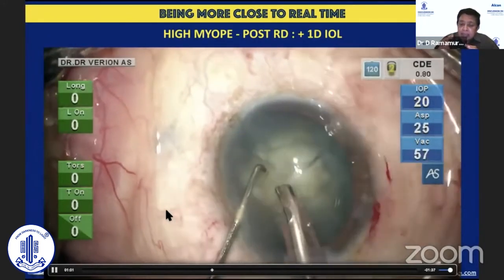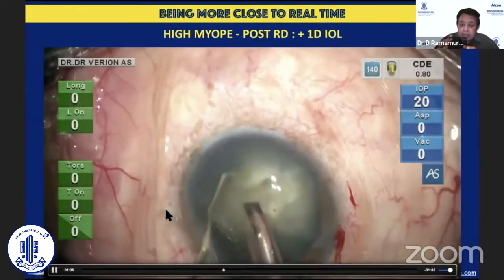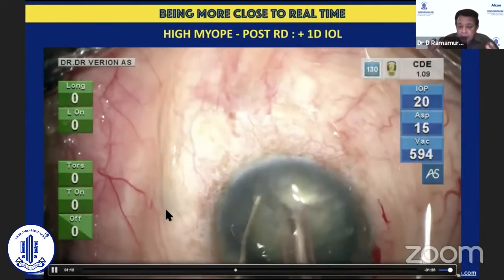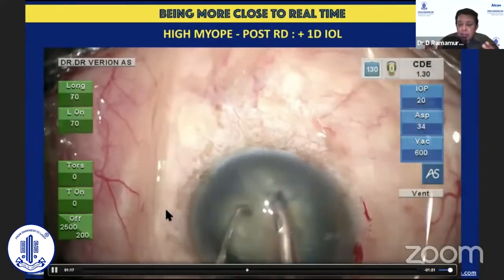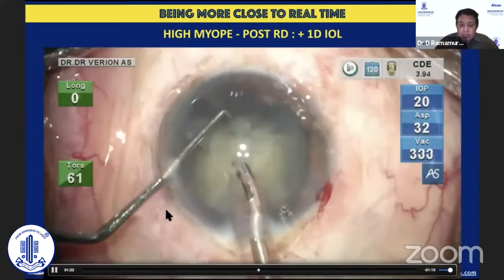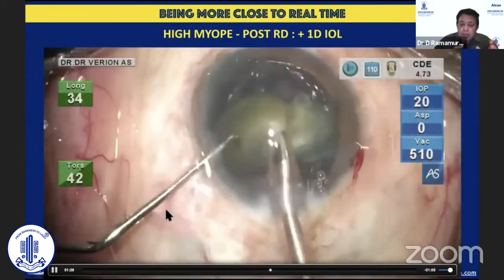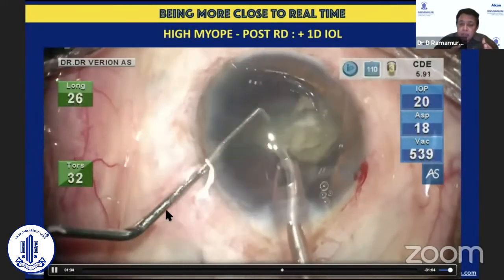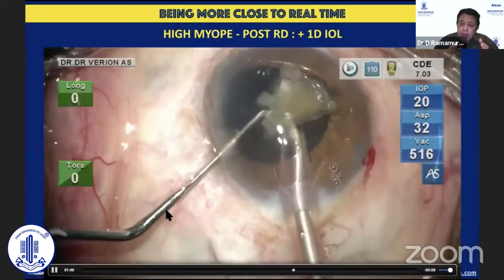But having said that, in this particular case, because the anterior chamber depth was almost 3.8 millimeters, I decided to opt for an extremely low intraocular pressure, which allows me to ensure that the anterior chamber is not too deep and allows the procedure to happen in a more controlled manner. Another important factor I need to mention is that when I do the chopping, I use just longitudinal power, which I believe gives me better holdability. But when I do the fragment evacuation, it's only torsional phaco that I use, which I believe gives me more followability and optimizes the phaco setting.